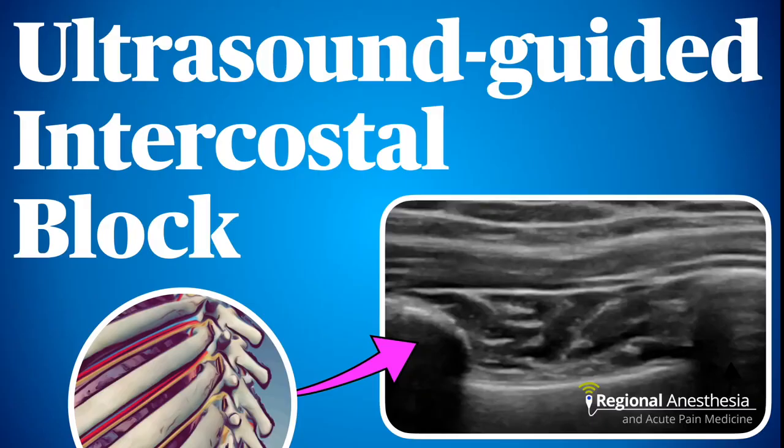Intercostal block is a long-standing technique for providing analgesia to the chest wall. It's superficial and relatively simple to perform, especially if you follow the steps outlined in this video, in which we'll describe the anatomy, sonoanatomy, technique, and offer some tips for success.